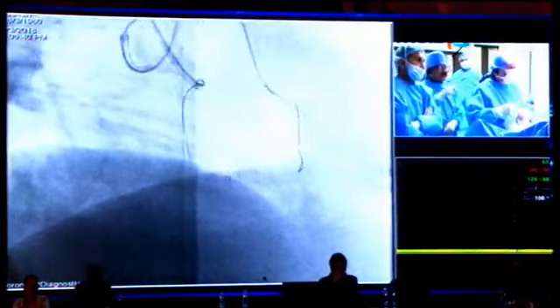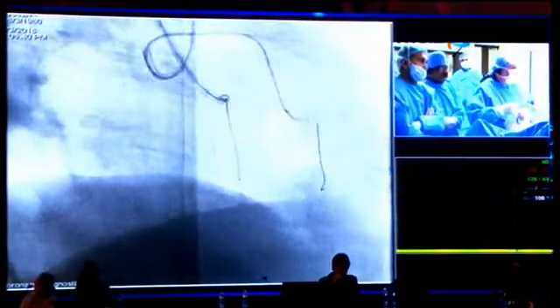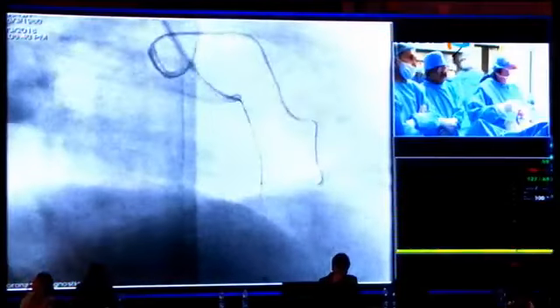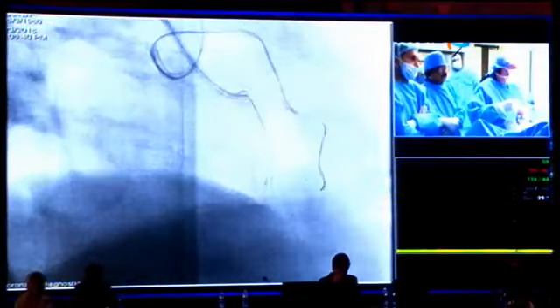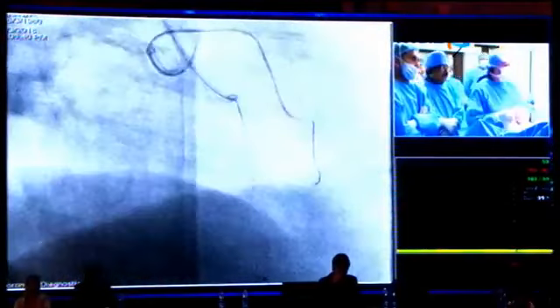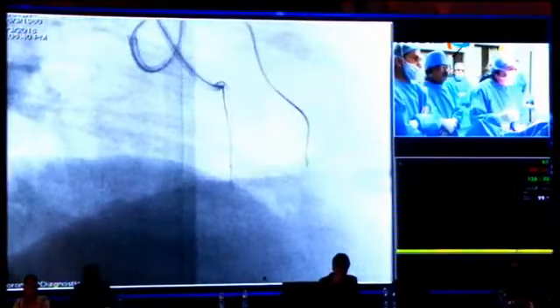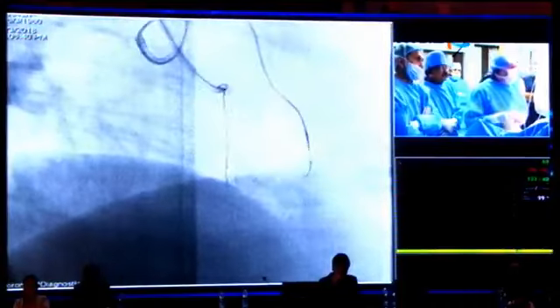But now there is a bend. Again there is a bend. Yes, one more bend. Posterior. And then it has to move forward. Let's not ruin it here. Yeah. There seems to be another sharp bend. Yeah, sure. Okay.